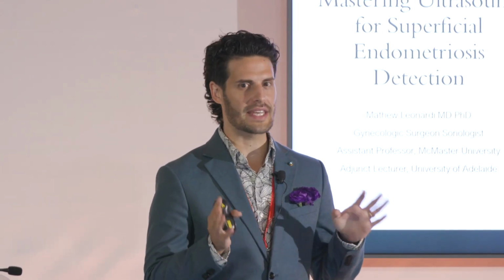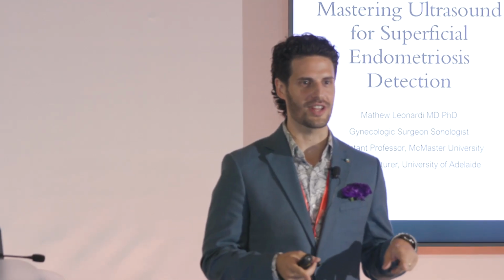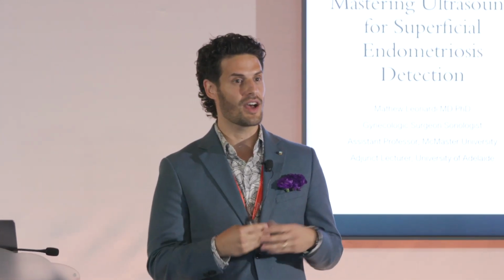Who here in the room scans? Put your hands up. Everybody, wonderful. Who here in the room has seen superficial endometriosis on ultrasound already? Lots of you. Okay, so we can make it a bit interactive as well. If anybody has any questions or comments, things that we can all advance and do better on together, we can definitely have that conversation.